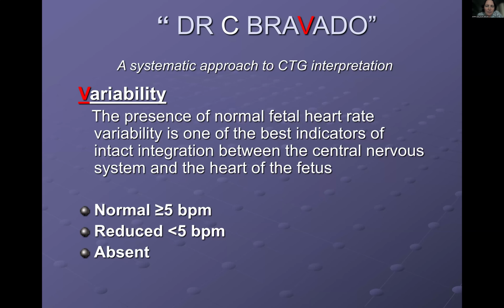Because ultimately we're doing this test, we're checking the fetal heart rate during the CTG, as I said, because it's an indirect measurement of the fetal oxygenation.